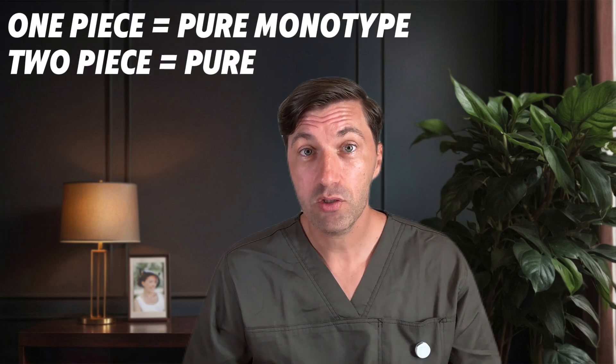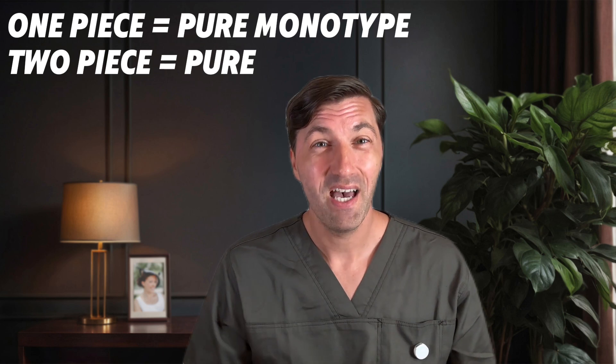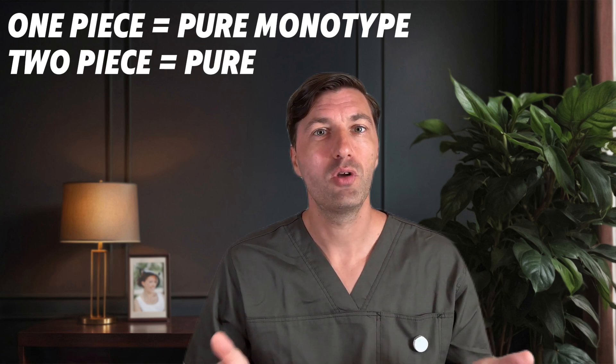Basically, Straumann offers two options: a one-piece implant called the Pure Monotype, and a two-piece implant simply known as Pure.